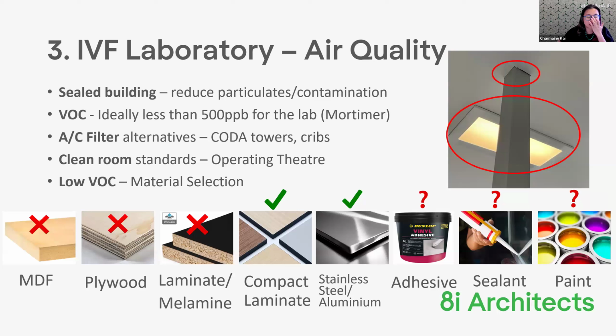So the next one, leading on from air conditioning, is air quality. So Keshav's already sort of mentioned the importance of air quality, particularly in a lab. One of the first things before we even get on to VOCs is to make sure that the space in the lab is sealed.